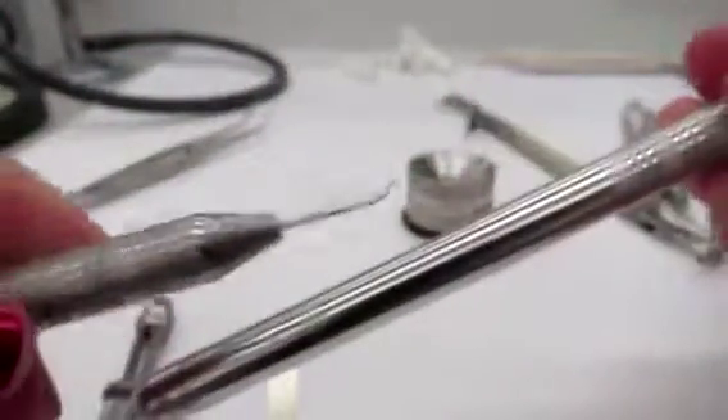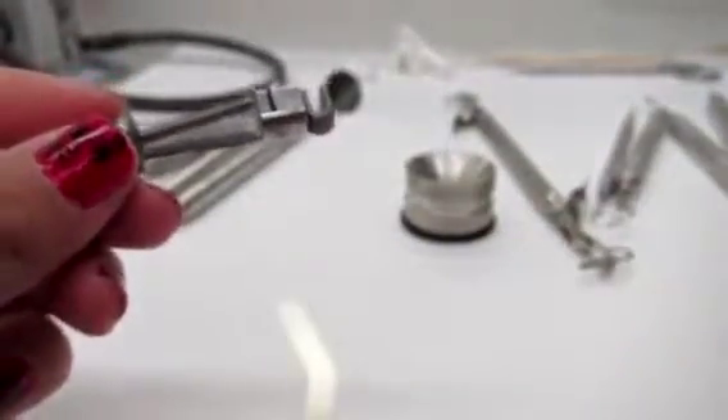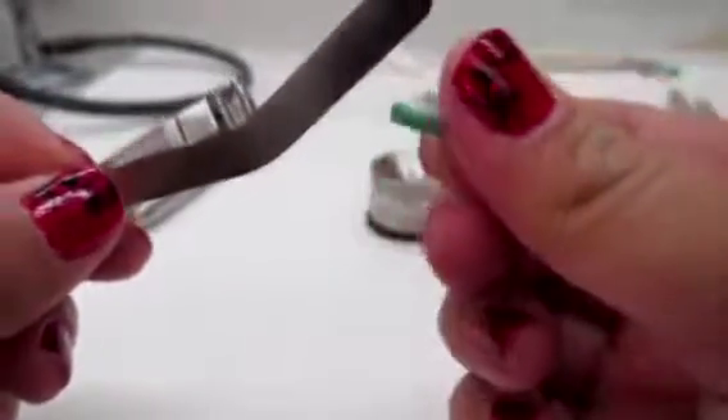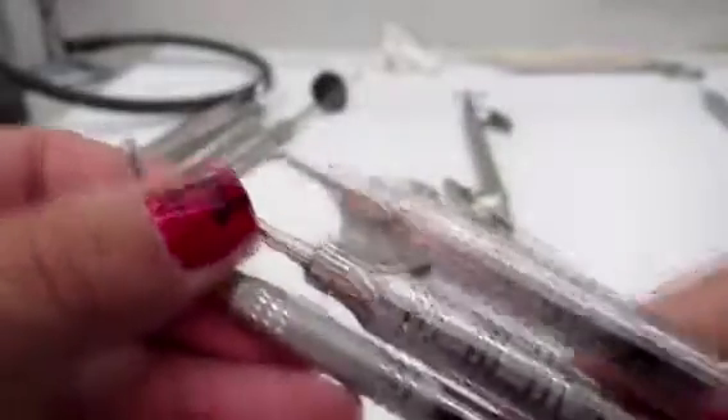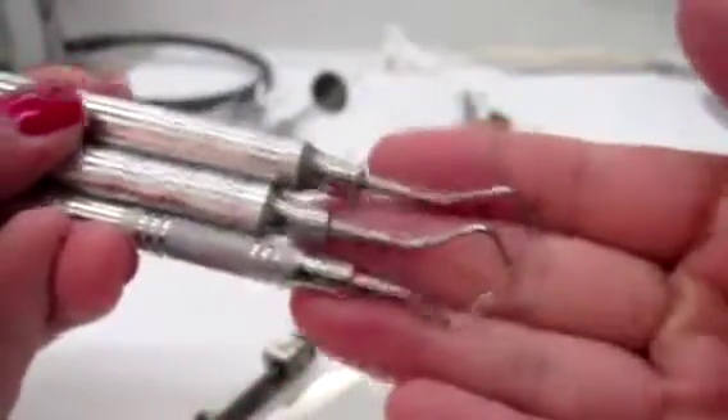So we're going to take you step by step. First thing you're going to need is your basic everything: your mirror — well you don't need the probe but you need an explorer for sure — and you need cotton pliers. You're going to need a matrix band, a Tofflemire retainer, and you're going to need a wedge. You want a nice thick wedge so that you can separate the teeth a little and make room for not only the band but a nice tight contact. You're going to need your amalgam well, an amalgam carrier, and then your condensers. They come in all different sizes — you start with the smallest one and work your way up.